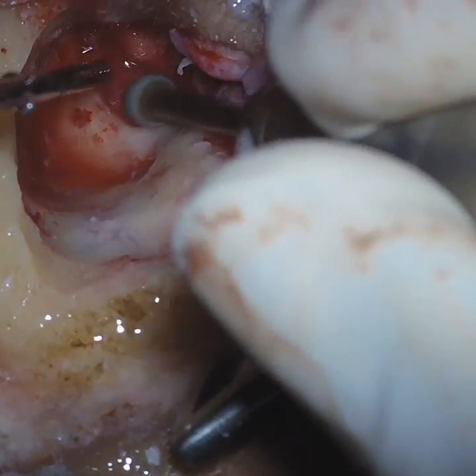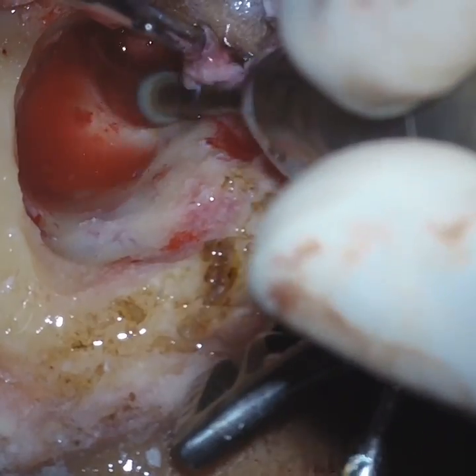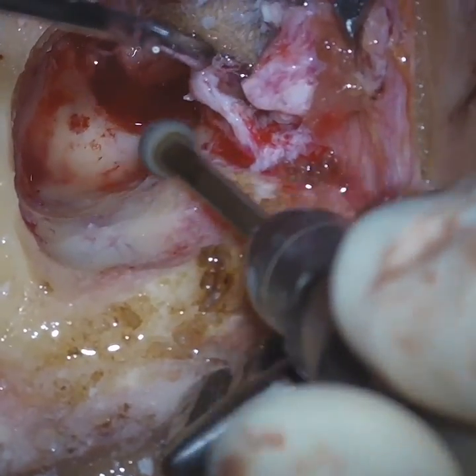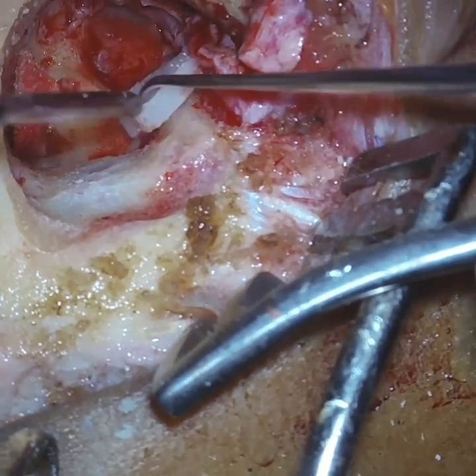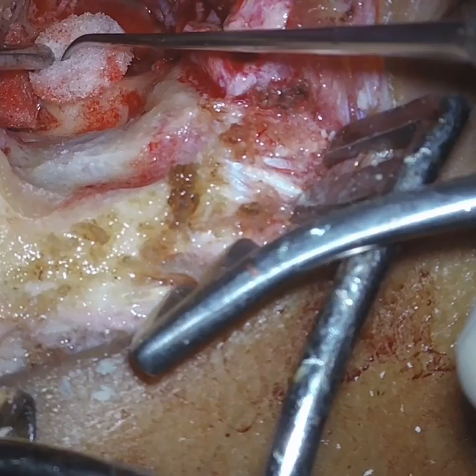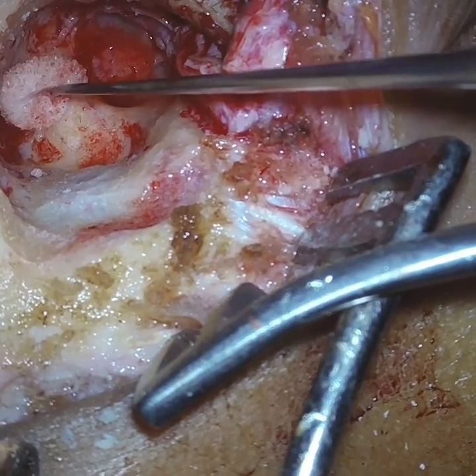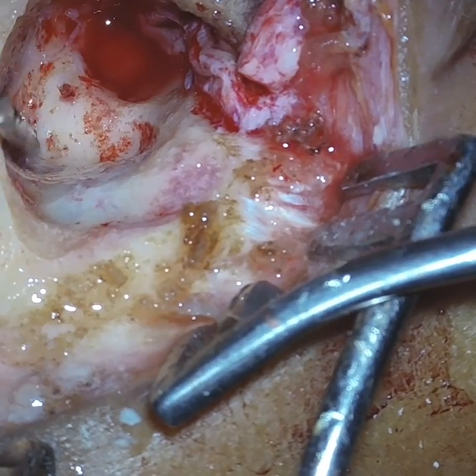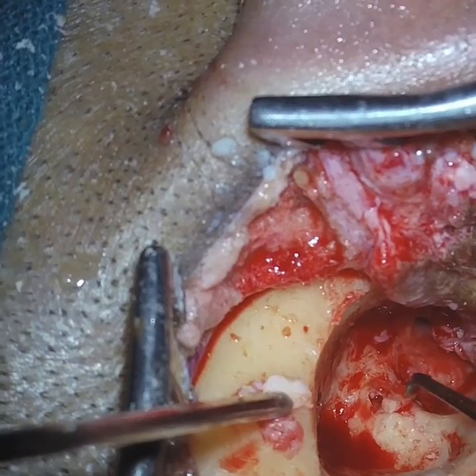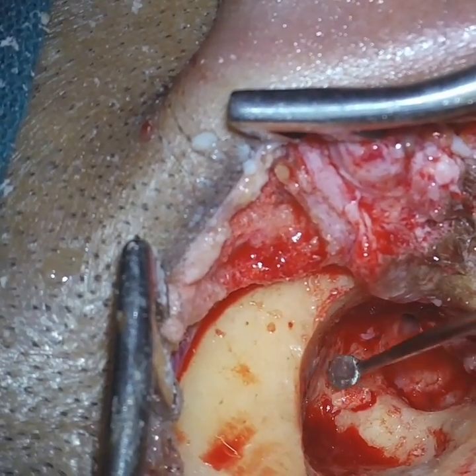Now we are coming to the fistula. So we are taking the granulation. Now you see it's a very big fistula. It is most likely a type 2 fistula, where the bony labyrinthine endosteum is eroded. So in such a fistula, you have to plug the fistula with cartilage. If only superficial fistulas are there, you can just put temporalis fascia. But for fistulas like this, you need to plug with cartilage, and cartilage is a very good material.